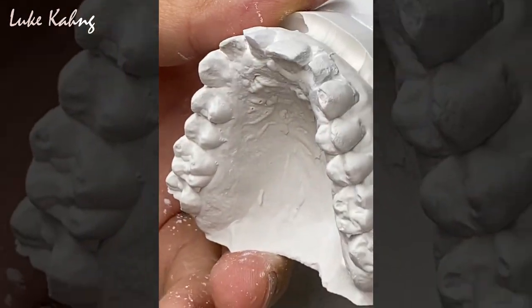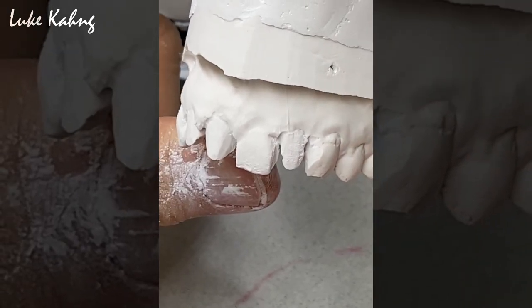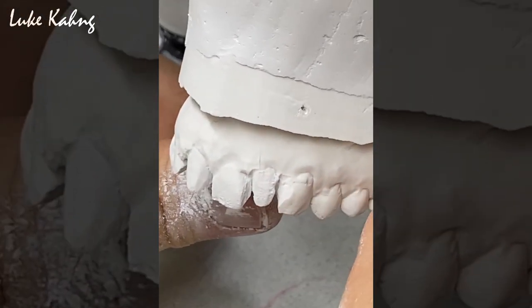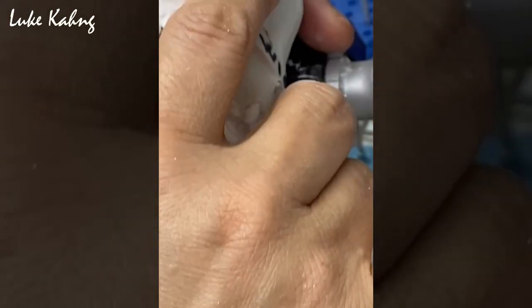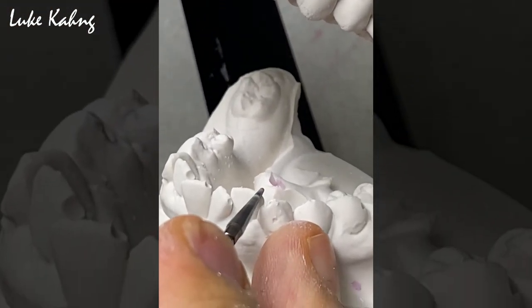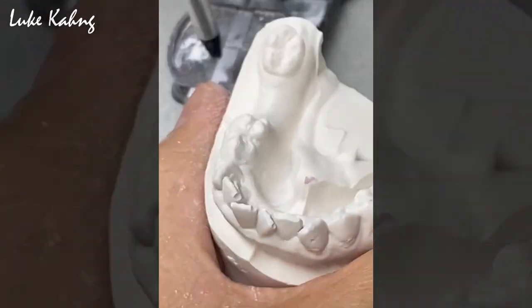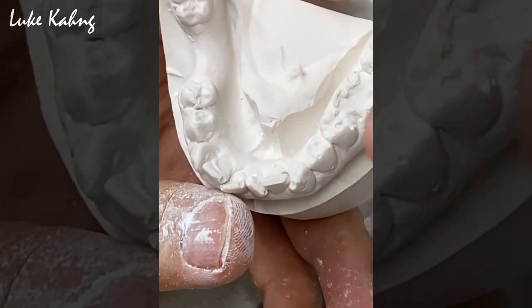Anyway, after I cut it, let's make a good buccal corridor alignment. Maybe I suggest a gingivectomy for the dentist. And then after that, I can contour this lower, just like here. I grind more towards lingually, right? It's the backward compared to the upper.